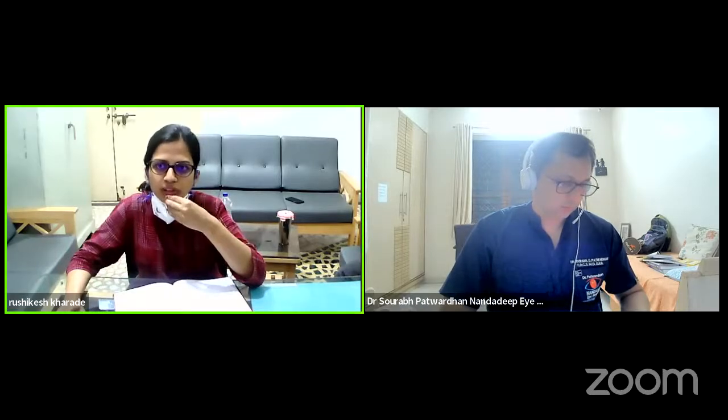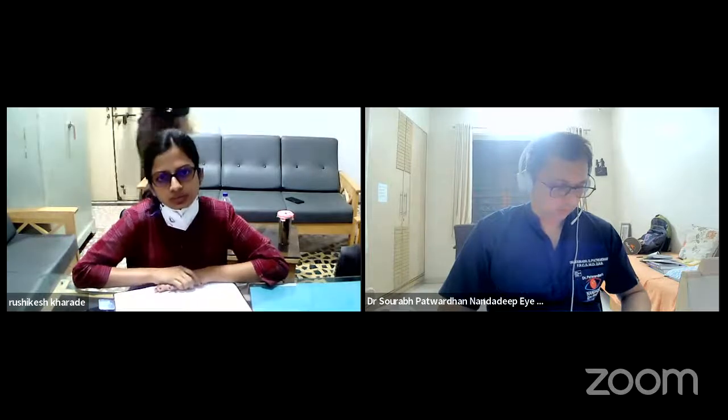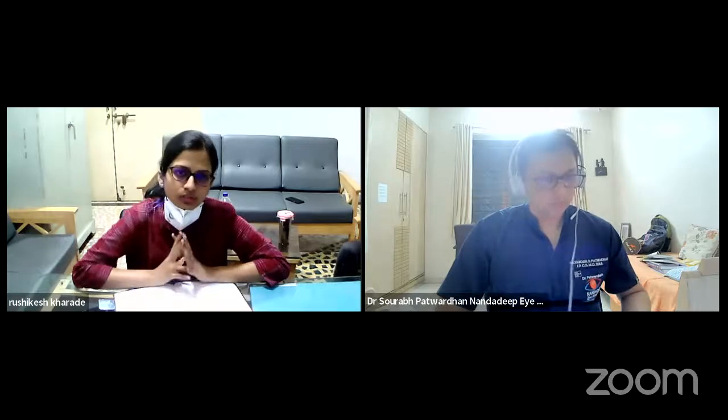Only pure longitudinal power for chopping. Yes, ma'am. With grade 2 NS, power can be 50. At least you should be able to go inside. If it is only longitudinal, it comes slowly, I feel. With torsional, we just go through and through because it doesn't stop and bury. With longitudinal, there is control. Even if you keep 70, you will feel a slight hold and then you stop. But it won't be like a bury in a hard cataract. You just slightly bury it and then mainly use your left instrument to chop it.